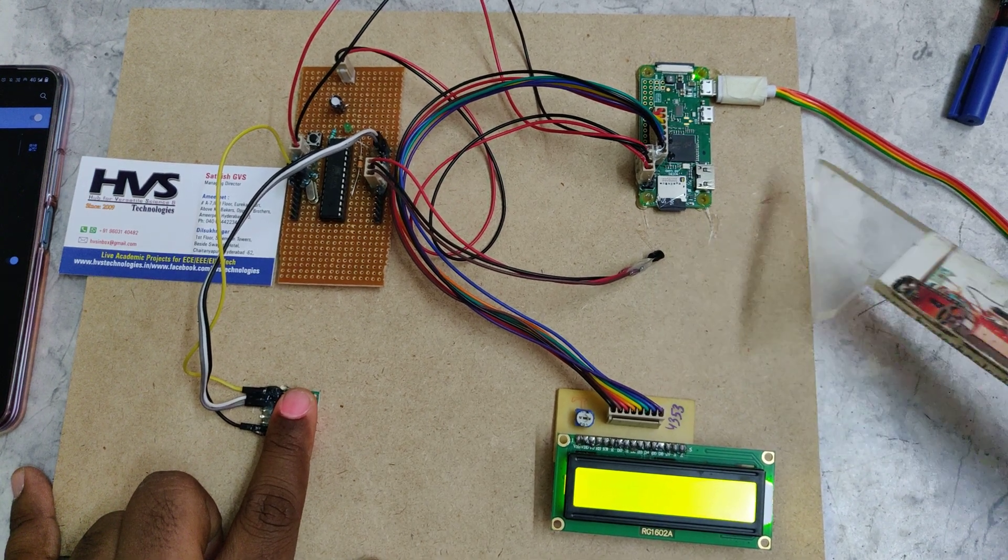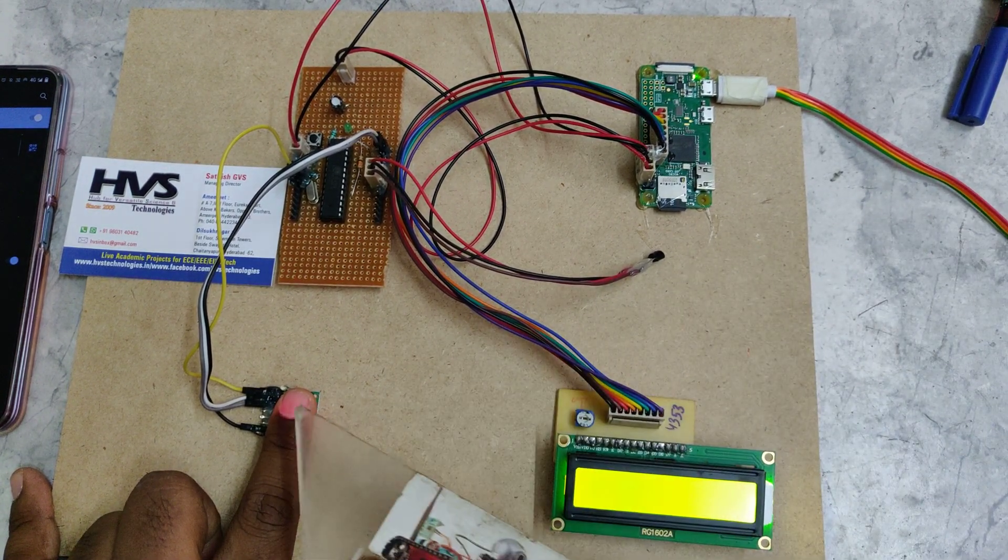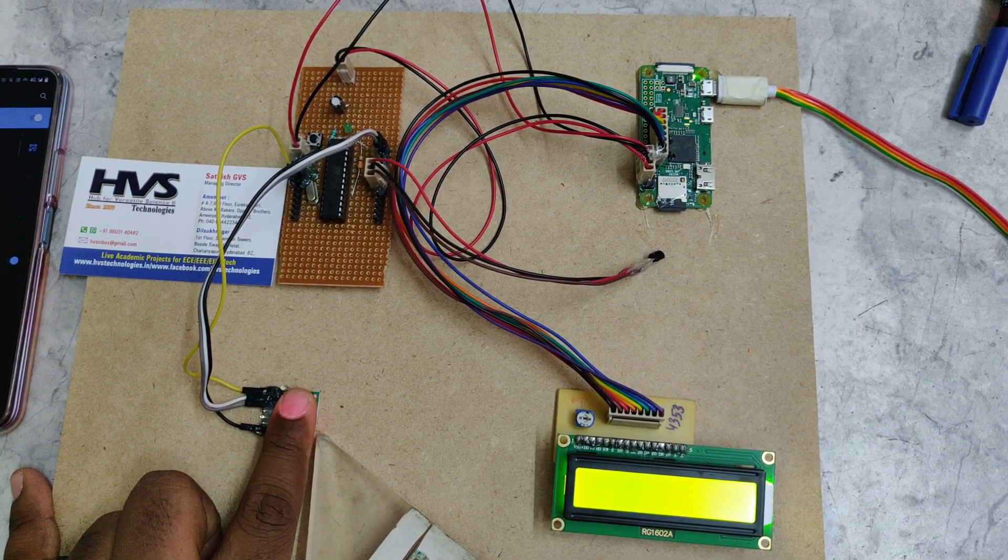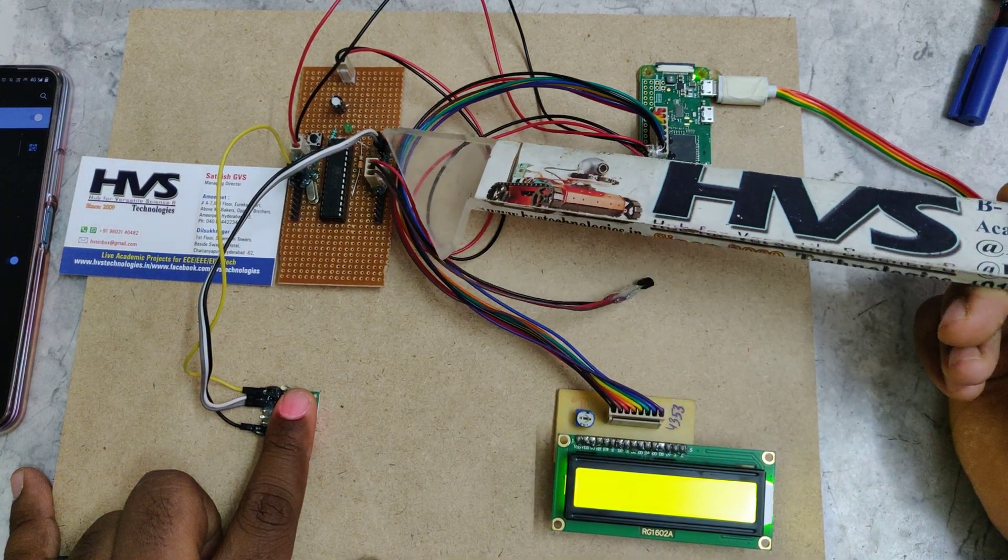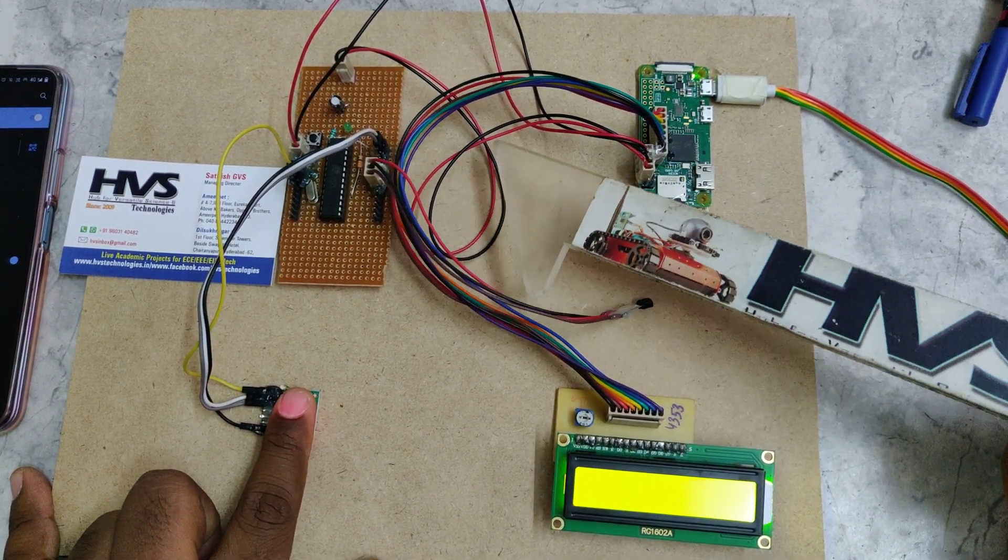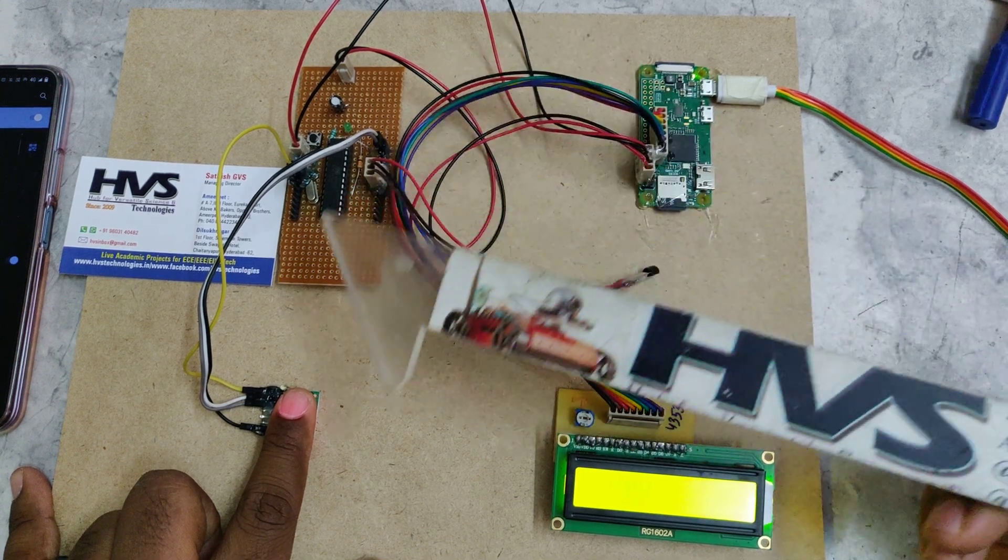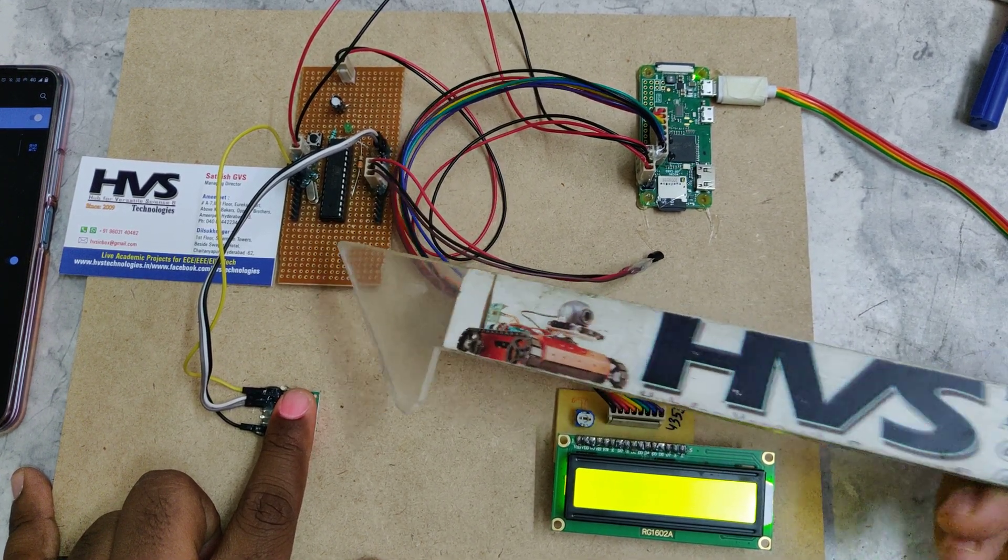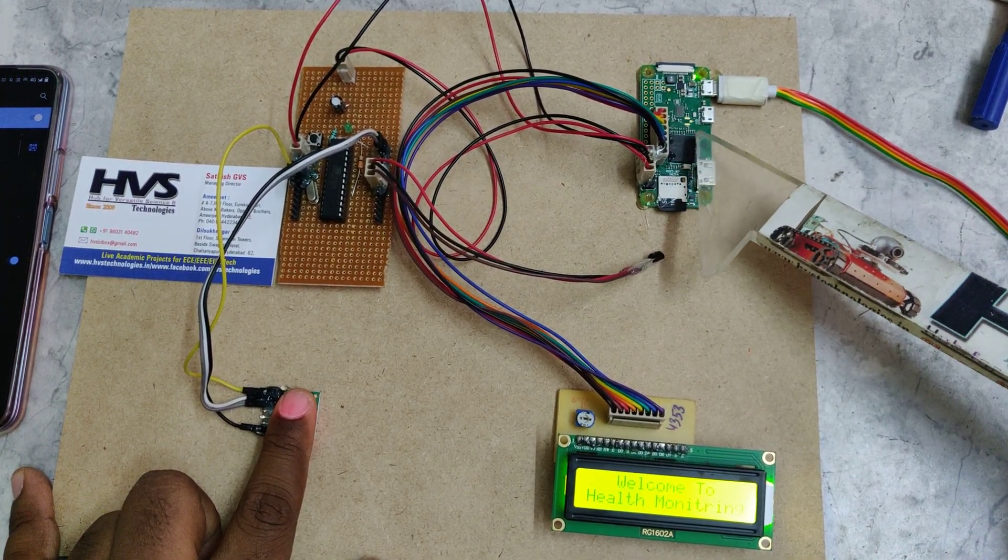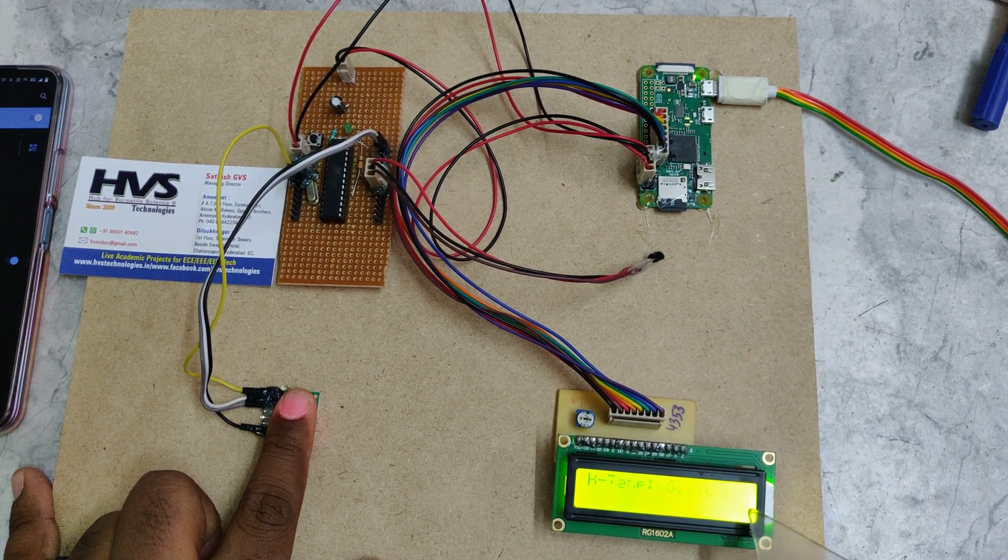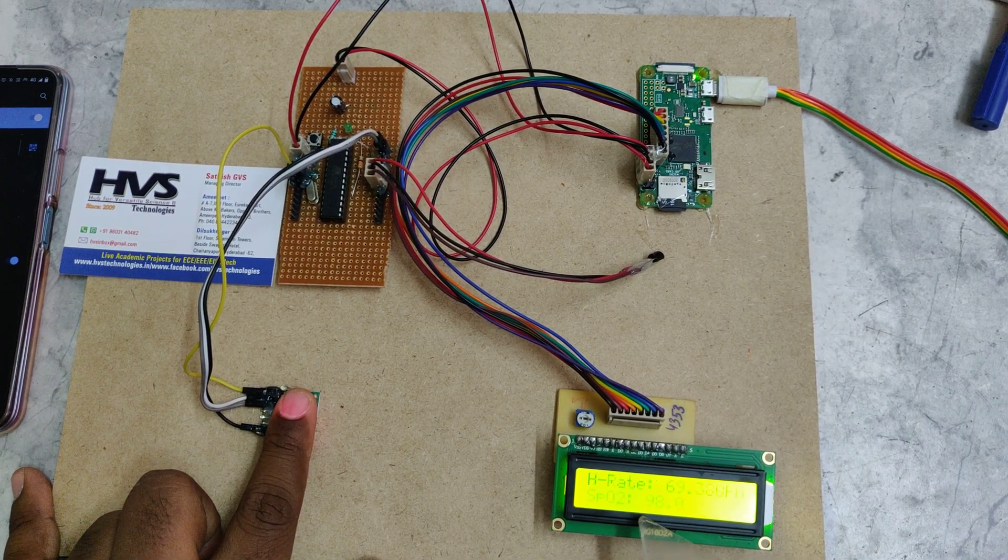Coming to the interfacing connections, the MAX30100 is interfaced at A4, A5 pins of the ATmega, and LM35 is interfaced at A0. Why we are using this microcontroller is because the Raspberry Pi doesn't have the inbuilt ADC.